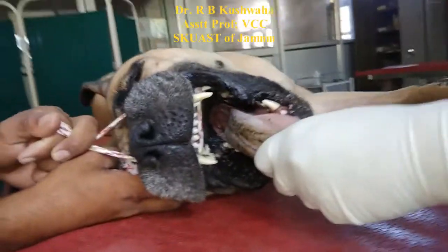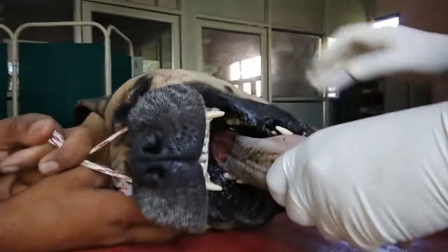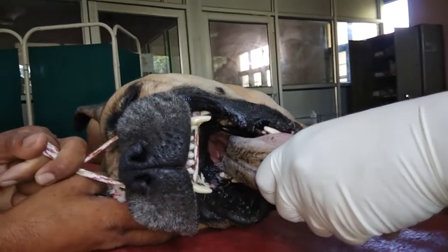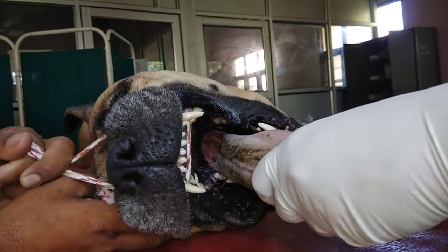I am going to demonstrate how to intubate an anesthetized patient. This is a 42 kg bull mastiff dog that is having the problem of intestinal obstruction.